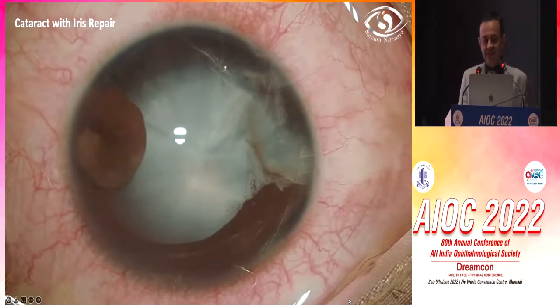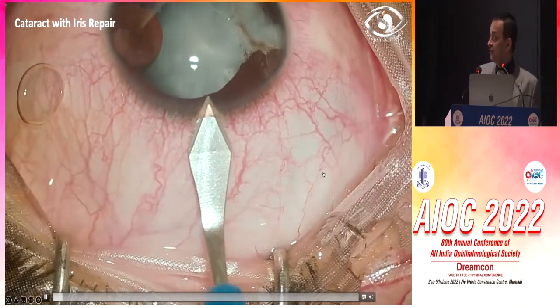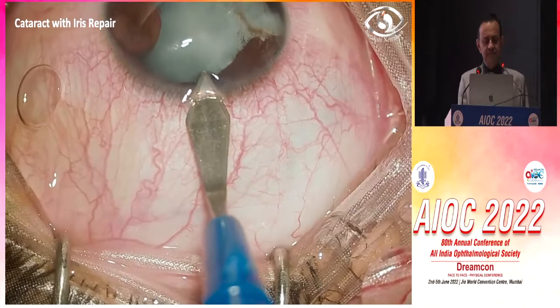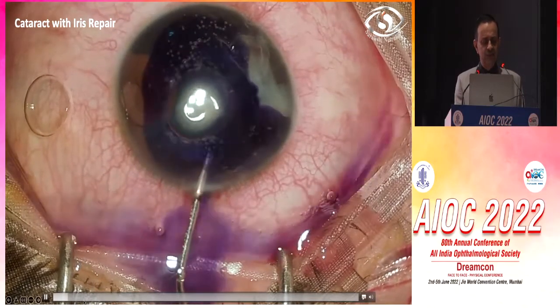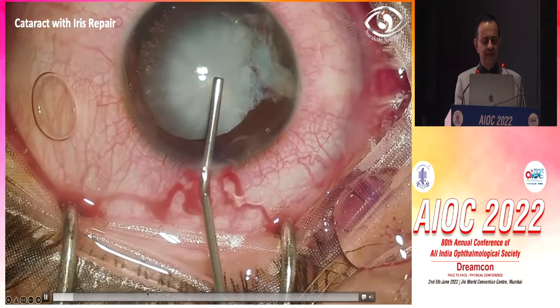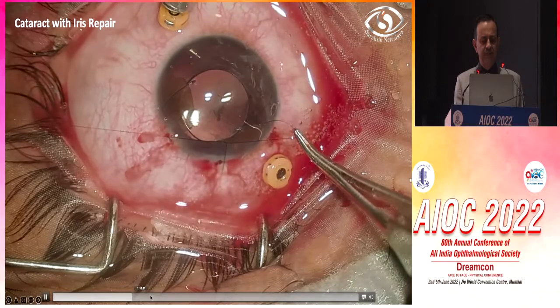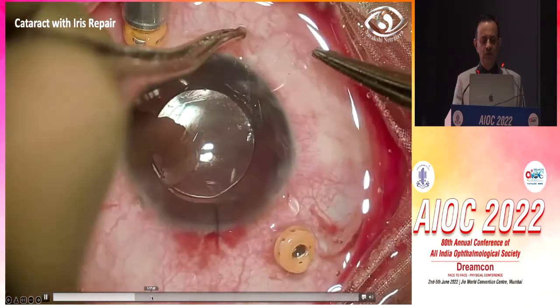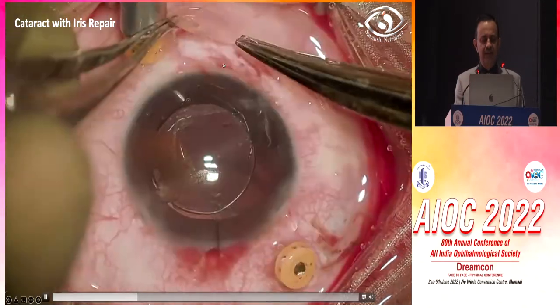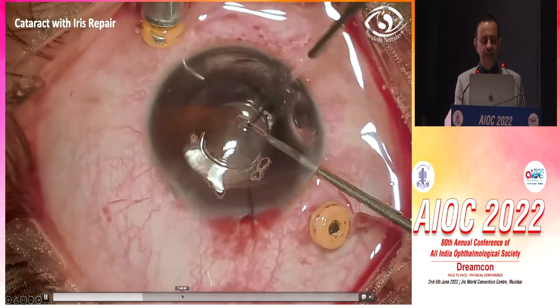You can see that the iris is lost from here to here. So I am planning to do a phaco with an iris repair, in such a complicated case. After completion of the phaco emulsification, the iris is being hooked, and then I am creating scleral pockets to anchor the iris and bring it over here, trying to create a pupillary area.